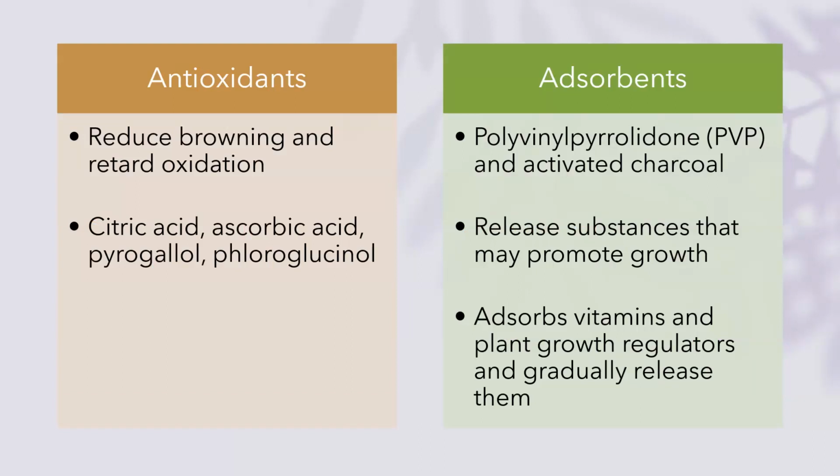Antioxidants are sometimes used if there is excessive browning of the explant, and they retard oxidation of the explant. Examples of antioxidants are citric acid, ascorbic acid, pyrogallol, and phloroglucinol.